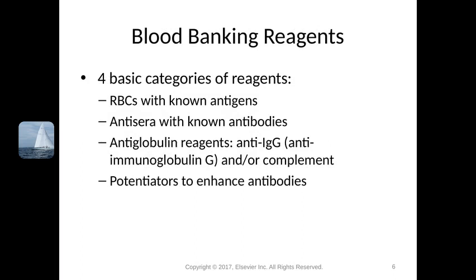So when we look at blood banking reagents, there are four basic categories. So red cells with known antigens, and then antisera with known antibodies.